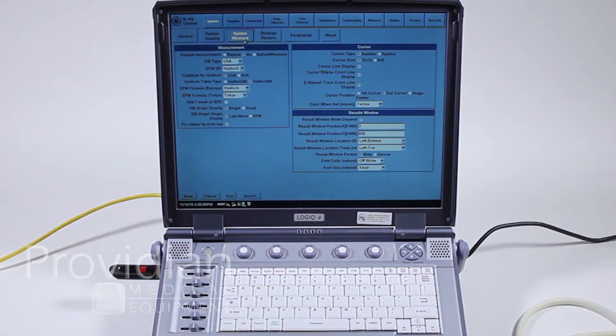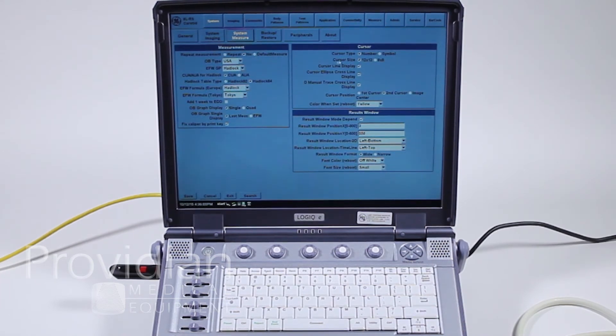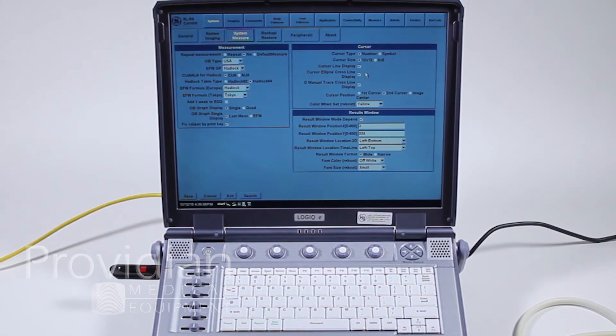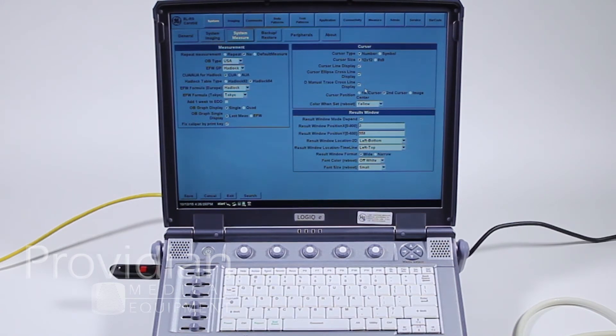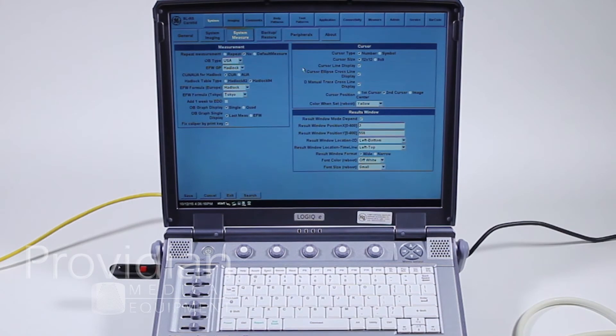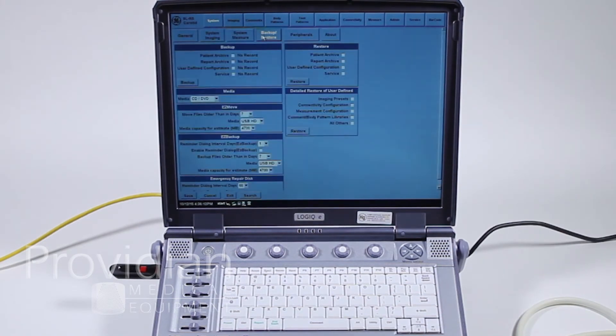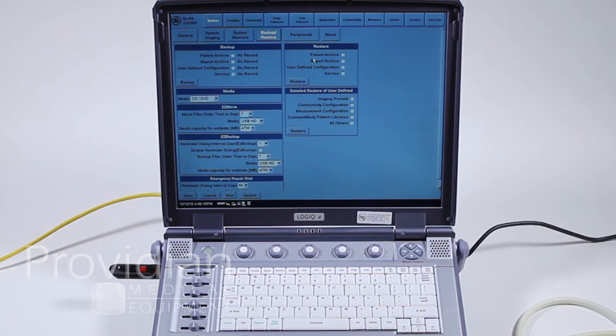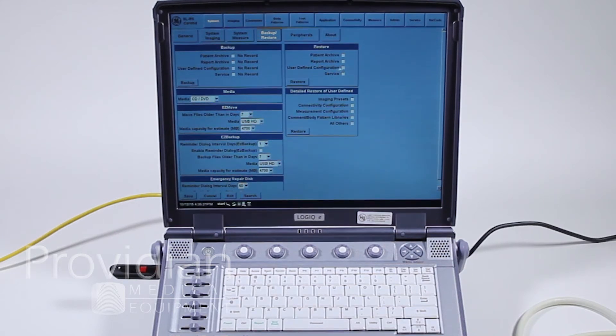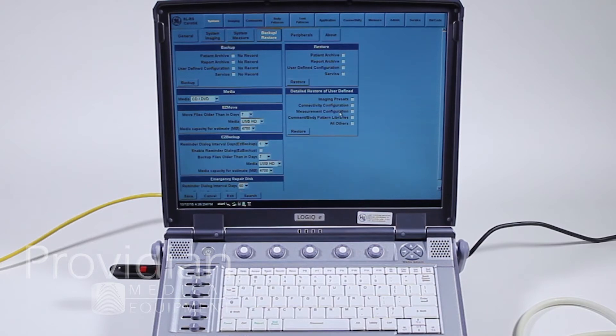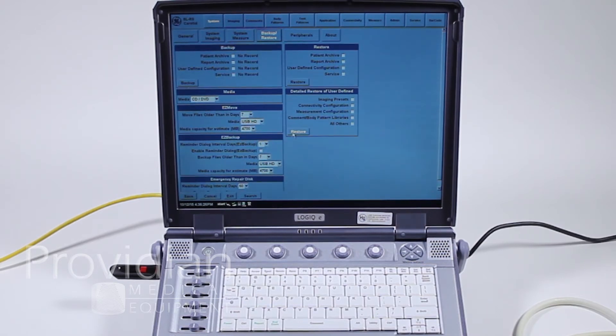Here are your measurements, your standard OBGYN measurements, type of cursors, how you'd want to look. I mean, it gets really, really detailed as to how you want to view the system. And to be honest, it's really a lot of overkill. Backup and restore. You can back up your settings, your patient archive, your user defined presets. We will talk about how to save presets and then detailed storing and restoring of the user presets.